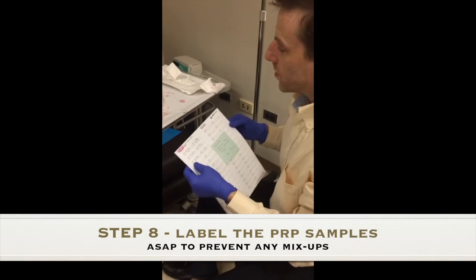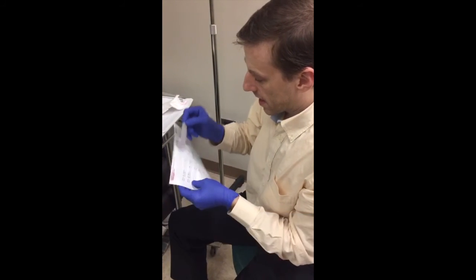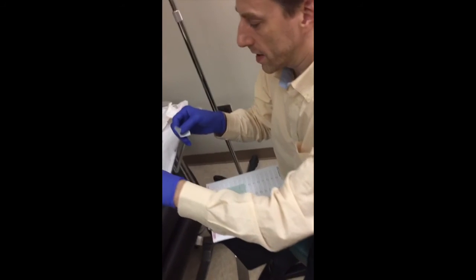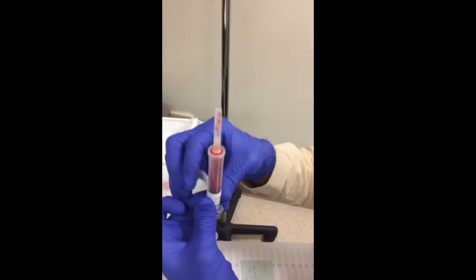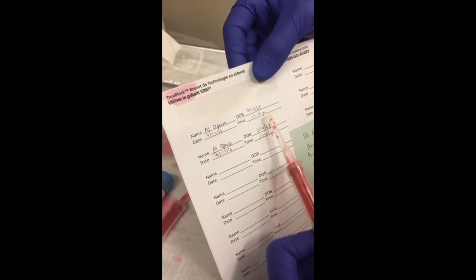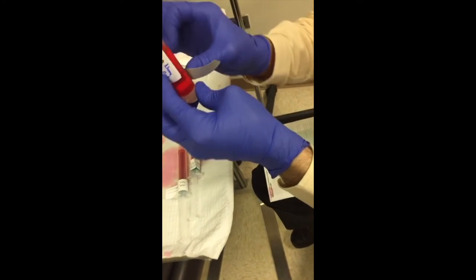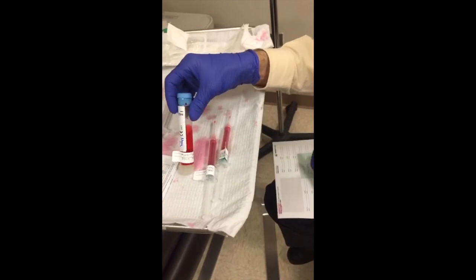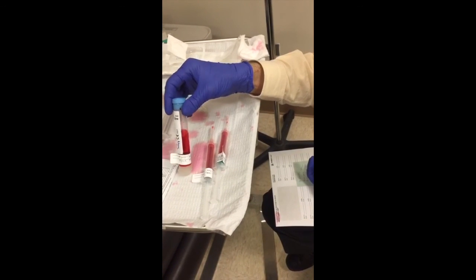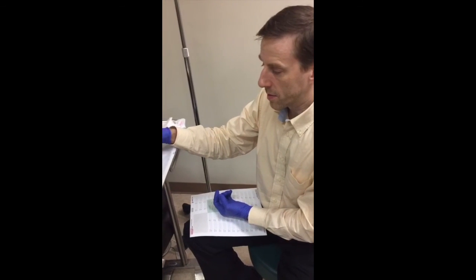Once your samples are ready, label each syringe with a sticker including the patient name — in this case 'Al Opisha' — date of birth, today's date, and the time. As a point of safety, I would not do two patients at once, because there's too high a risk of mixing up test tubes in the centrifuge. Do them in series so there's no chance of mixing up one person's blood with another's.